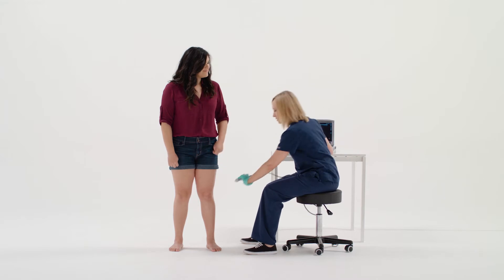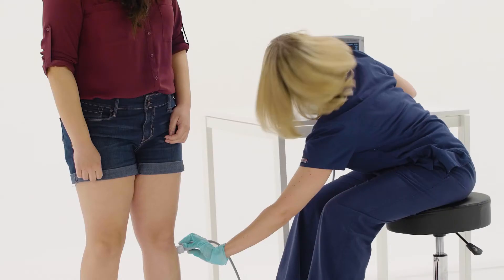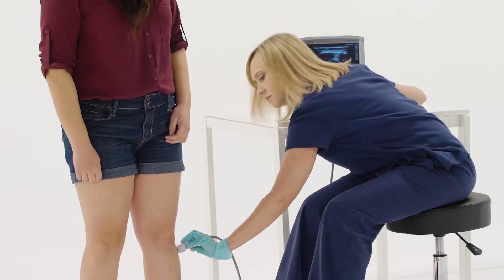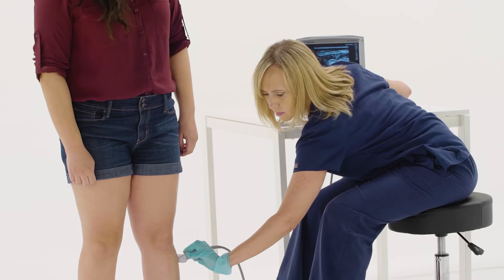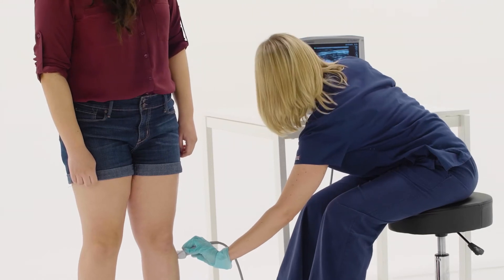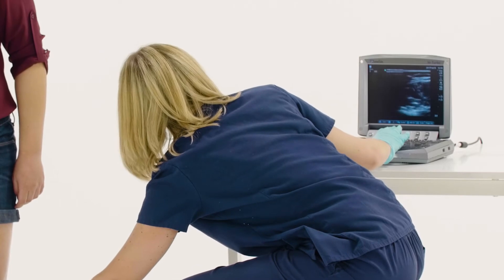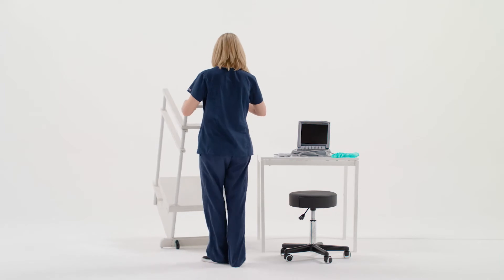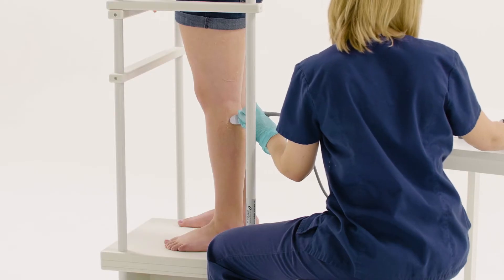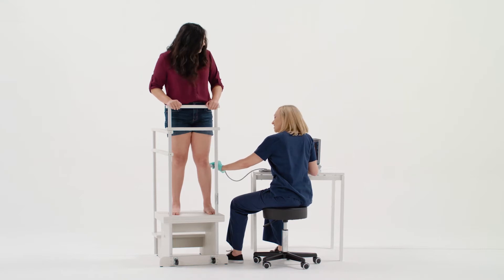Safeguarding both patients and employees is always a top priority in health care. But unfortunately, musculoskeletal injury is a common occupational hazard for sonographers. Bending over for extended periods of time can impact and strain the lower back, sometimes even causing permanent damage. That's why we've created the Vascular Sonography Exam Standard Step to make sure that both the patient and sonographer experience the utmost comfort during vascular ultrasound exams.